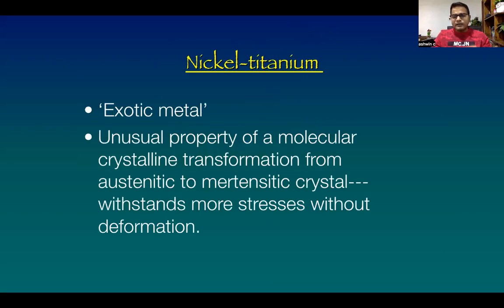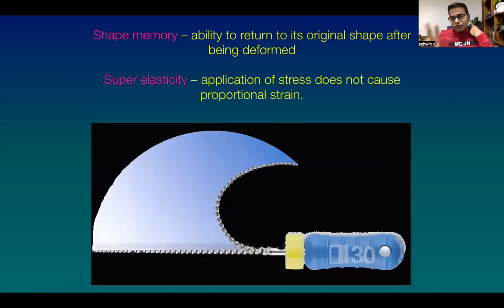So what is nickel titanium? Nickel titanium is an exotic material. It has two important properties. First is shape memory.